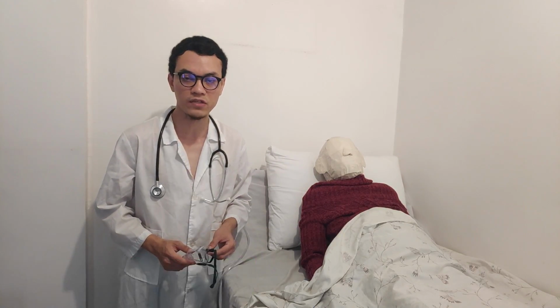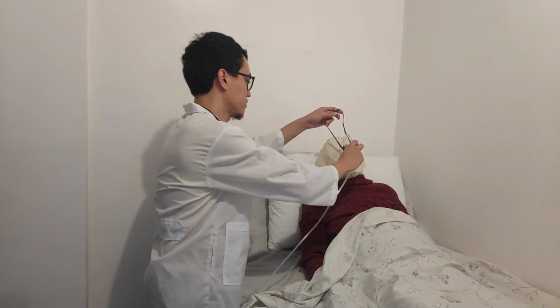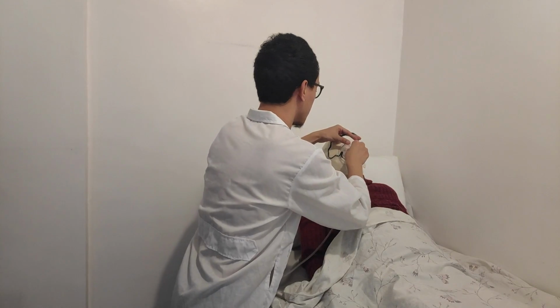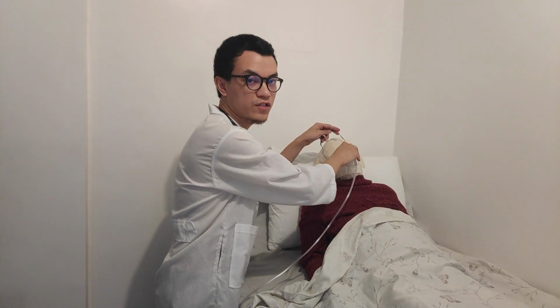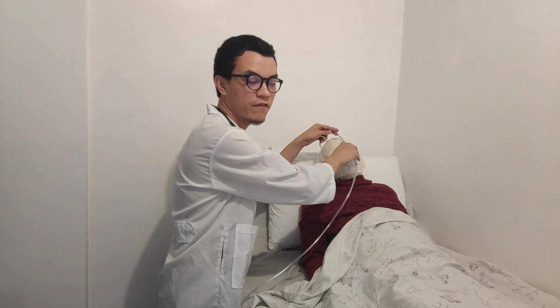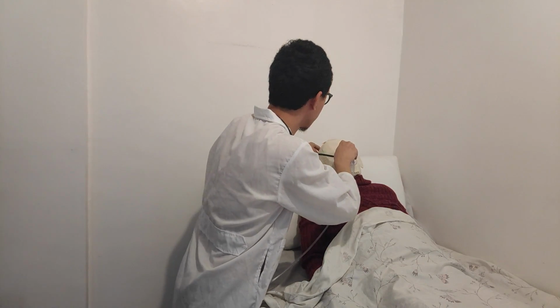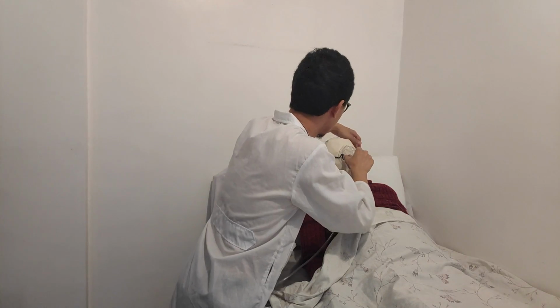Next is position the face mask over the patient's nose and mouth. And then adjust the elastic strap so that the face mask fits snugly but comfortably on the face. And then adjust the flow rate at prescribed rate.